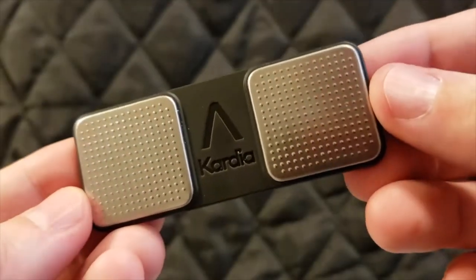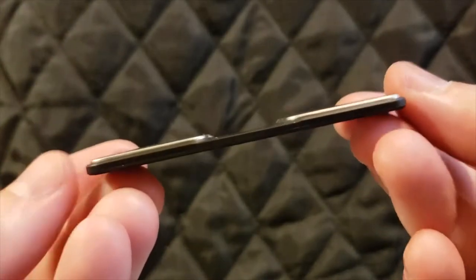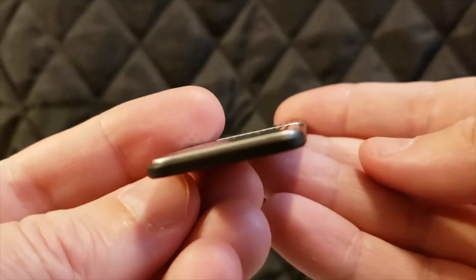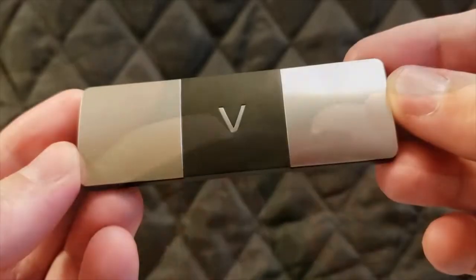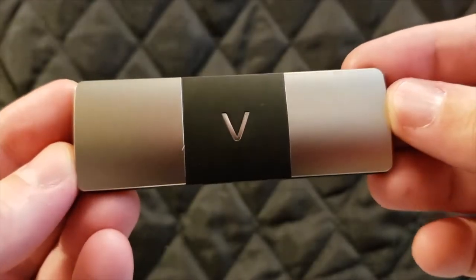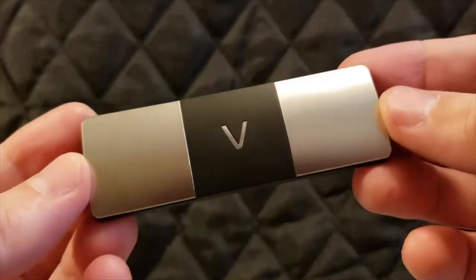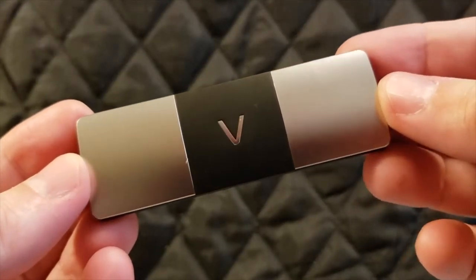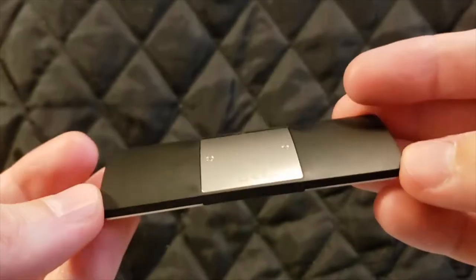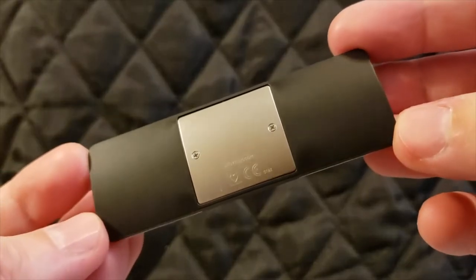Both monitors are very portable and very thin — you can take them anywhere you go. They both provide a lot of useful information about your heart and how it's behaving at any given time. They're actually a little bit different: the Alive Core one has six leads, so there are more ways for it to collect information, but it's all pretty straightforward.